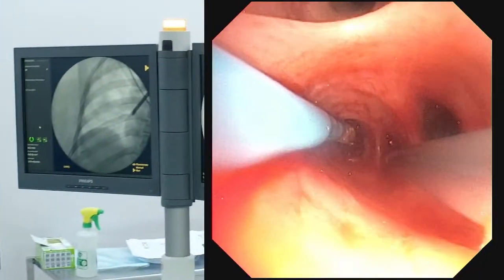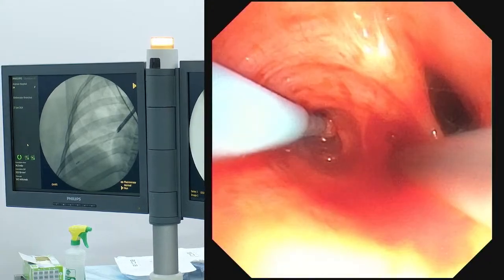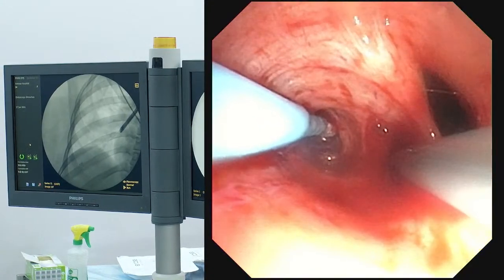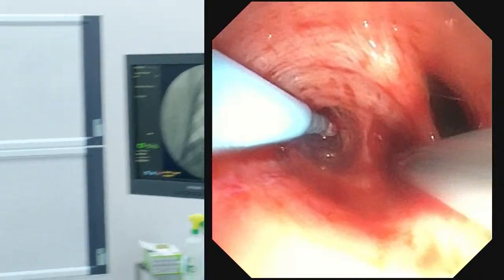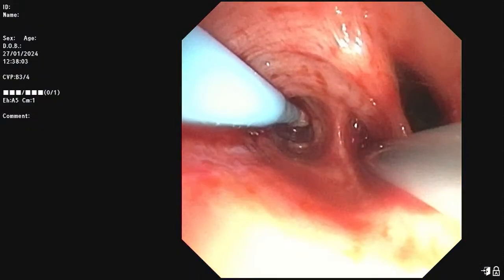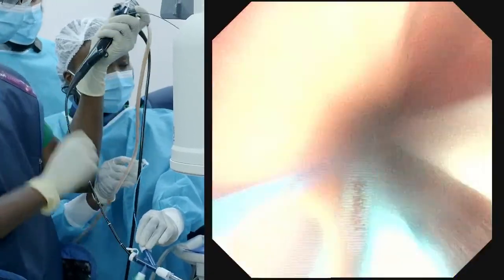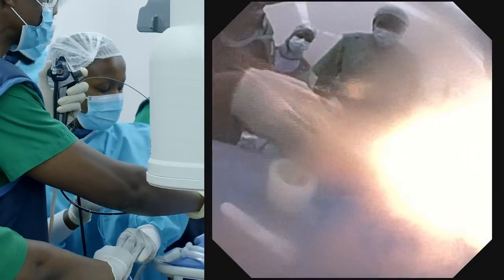Now come back. Yeah, that's okay, Andrew. That's fine. That's good. Now hold it nicely. Good. Other hand down there. And freeze 4 seconds. 1,000, 2,000, 3,000, 4,000. Out. Good. And don't release that pedal.